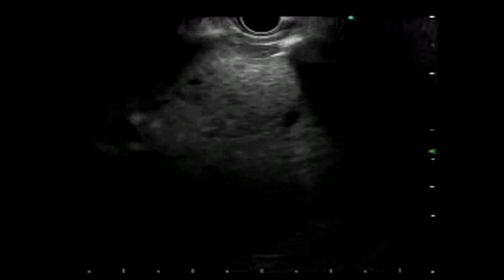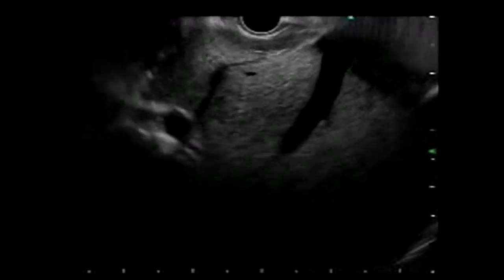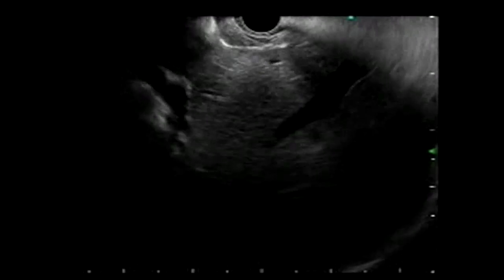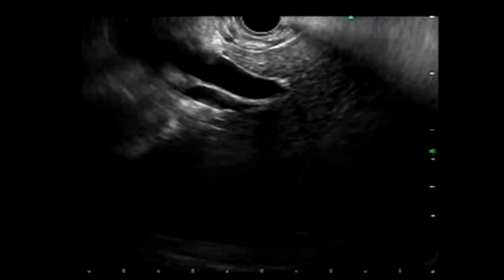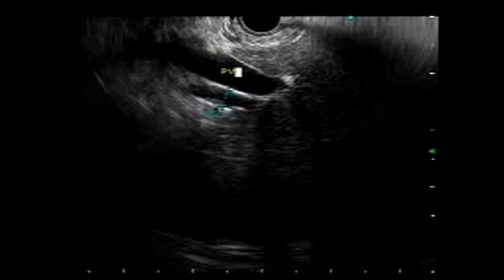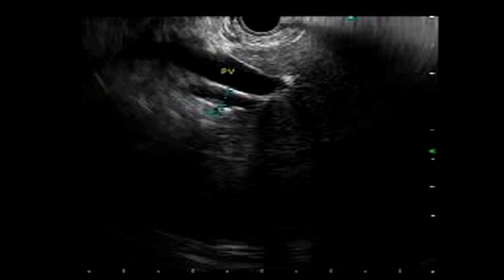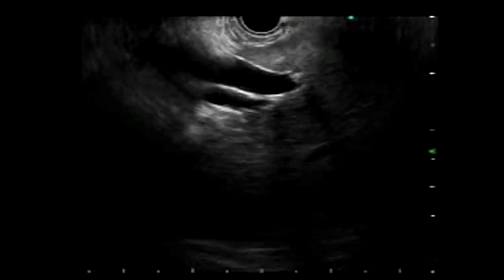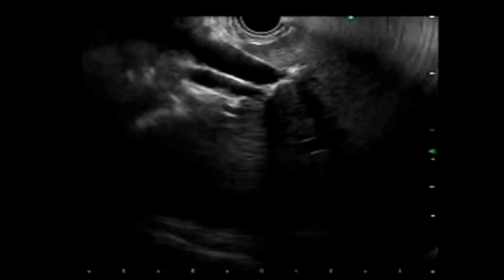Here you can see the inferior vena cava and hepatic veins being brought into view. The scope is then pushed a little down and you start seeing the hilum of the liver. With Doppler you can see the portal vein and the common bile duct at the liver hilum. Doppler can be applied to check the portal vein and its tributaries. Once the hilum is located, pushing the scope down shows the portal vein and common bile duct separating.